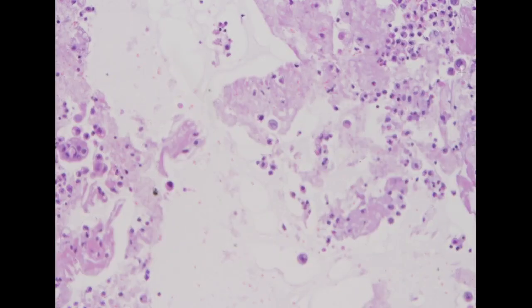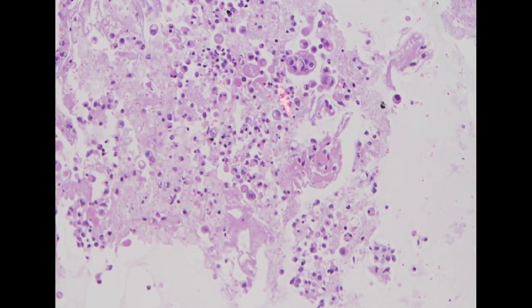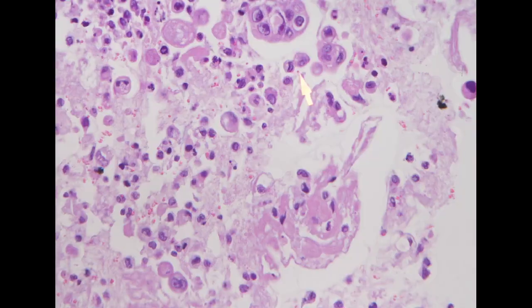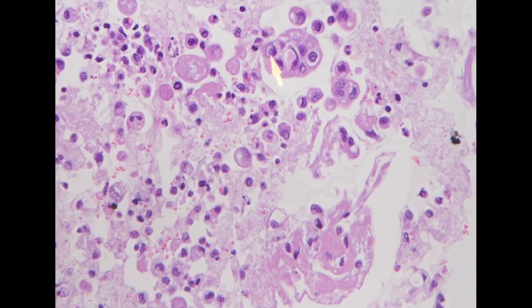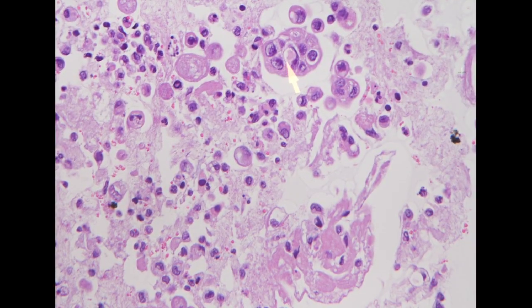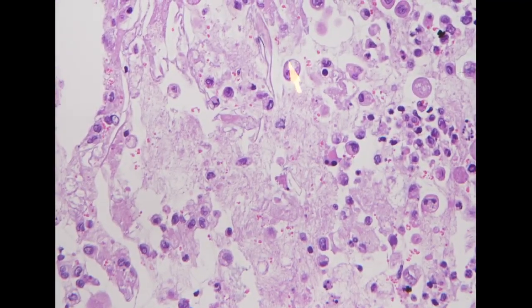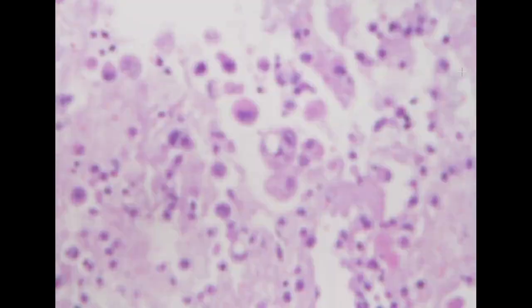In the cell block, we can see some areas show a more prominent cohesive glandular pattern. So this cluster looks much more like adenocarcinoma, but it is uncertain whether these single cells in the background are also cancer cells.